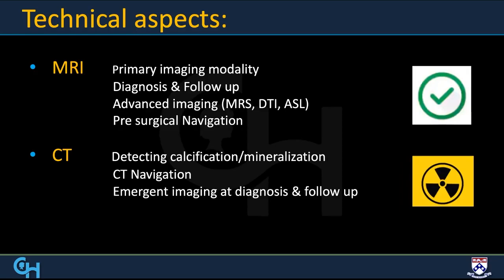Computed tomography or CT scan has its role. It helps in identifying calcification in these tumors, specifically with respect to osseous landmarks. The CT navigation is particularly useful.